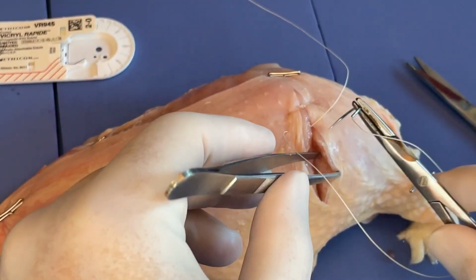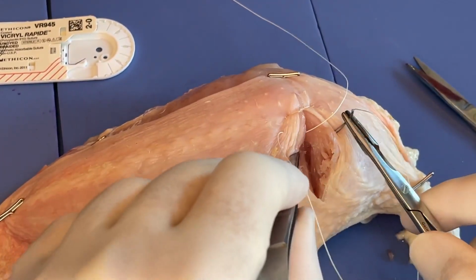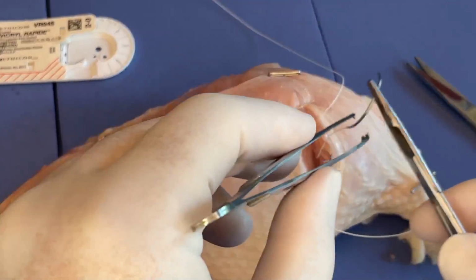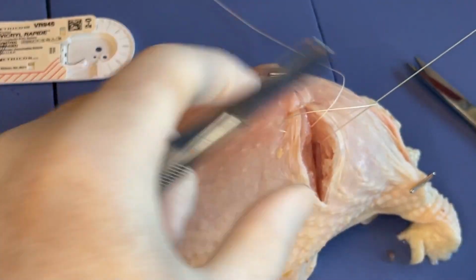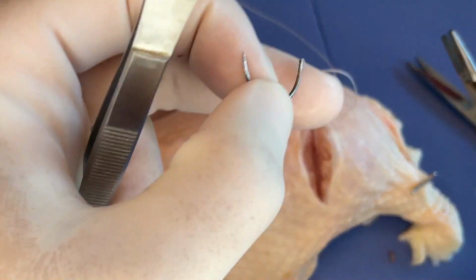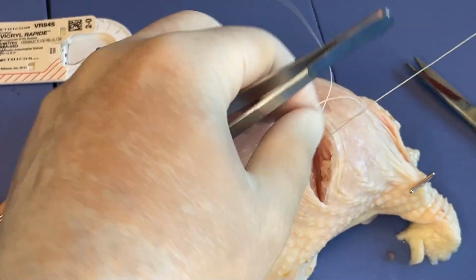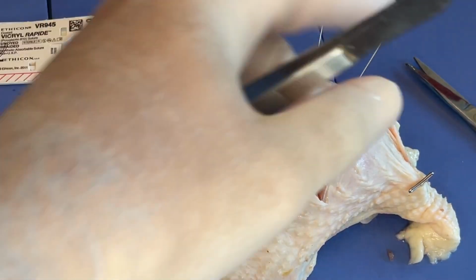Pull that through, and then we're going to come over to this other side and go out to in. So now our 2 loose strands, so to speak, are down in the interior of the tissue. I want to make sure that we're not locking that, which I was a little bit. So as we pull this through, we want to shorten it up so we have a relatively short side to tie there.